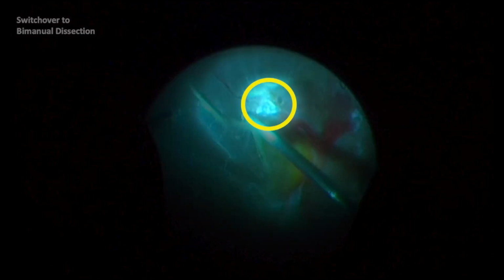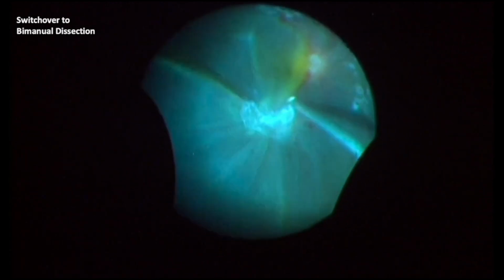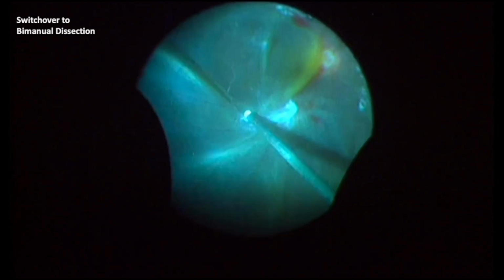The above case demonstrates the switch over to bimanual dissection. The initial membrane dissection and achieving hemostasis at the disc is extremely important for a bloodless field. One can notice an iatrogenic break and sudden gush of subretinal fluid inferiorly.